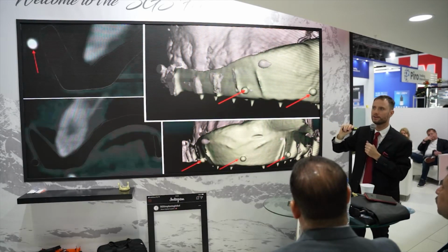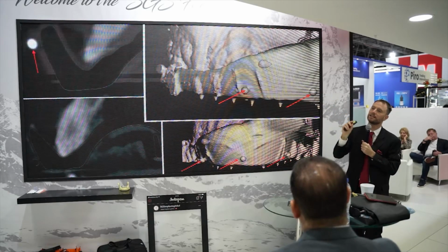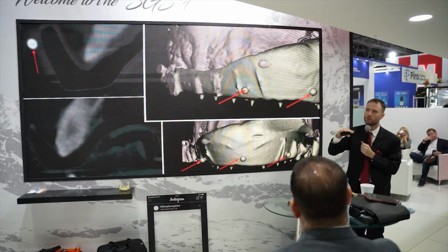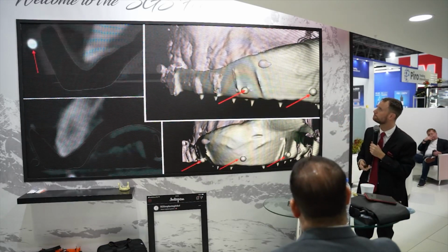The only critical thing, you need to have the radiological points. Usually they say you have to have 3 points, but I know most software needs 6 to 7 points to be precise. So I'm always going for 8 or 10 points usually.